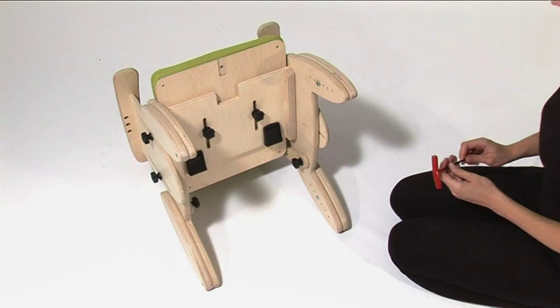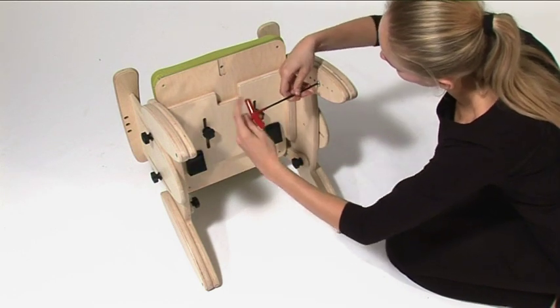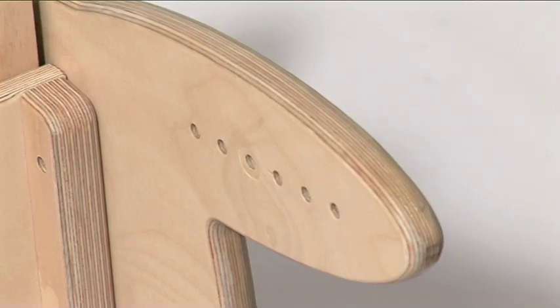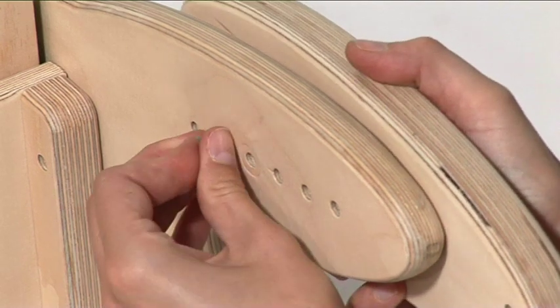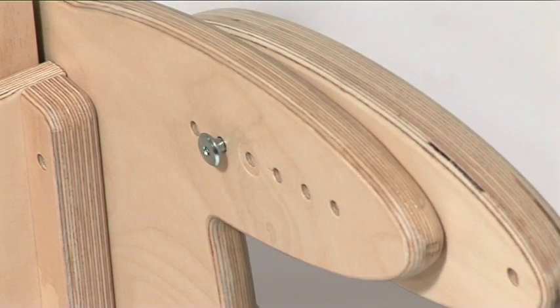To adjust the seat height, lay the chair on its back. For each out-trigger, identify and remove the securing screw. Position each out-trigger leg to the desired height. Insert and tighten each securing screw to affix the leg out-trigger in place.